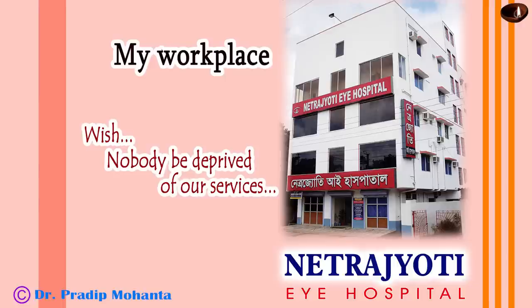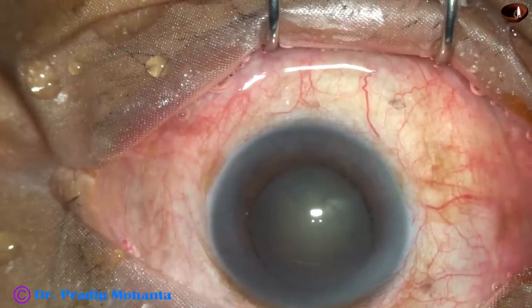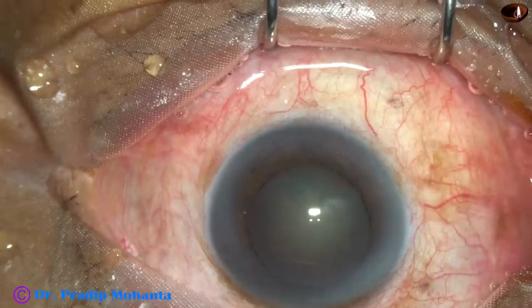Young colleagues, welcome to my workplace at Ranaghat, West Bengal, India. In this video, I want to demonstrate a manual small incision cataract surgery for first-year ophthalmology residents all over the world.